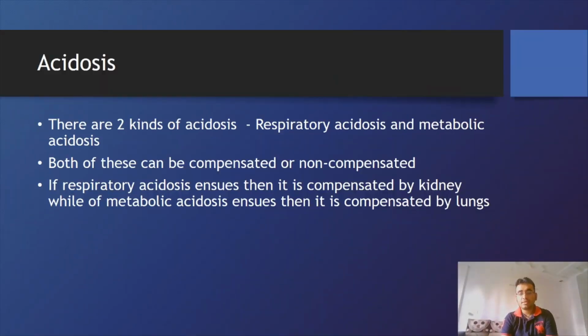Since most of these patients are in an ICU, you are regularly checking their ABG levels. So how do we monitor and manage these patients based on those findings? That is what we'll be learning today in the acidosis part, as well as learning in brief about BiPAP and the ventilator in acidosis.